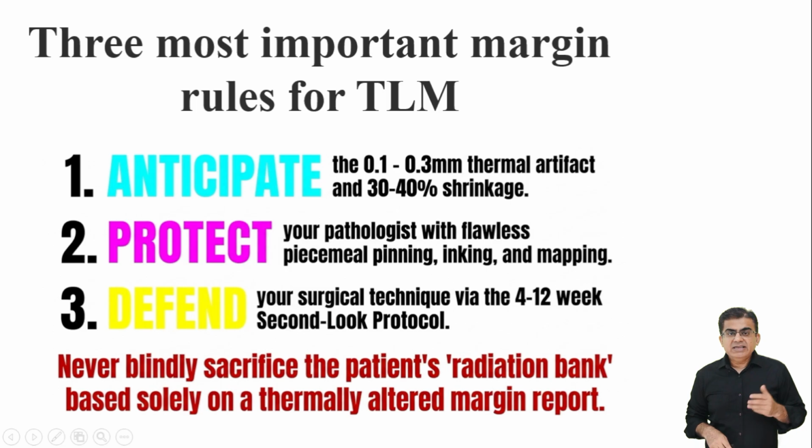Let us now summarize the three most important rules from this segment of our lecture. First, you must always anticipate the physical reality of the laser. You must absolutely expect a 0.1 to 0.3 mm thermal artifact along with a massive 30 to 40% tissue shrinkage.